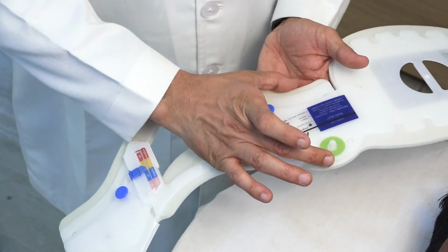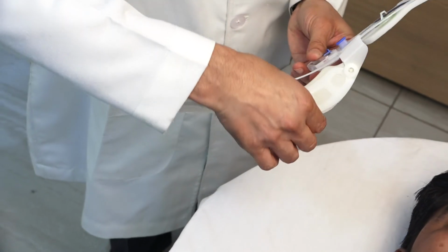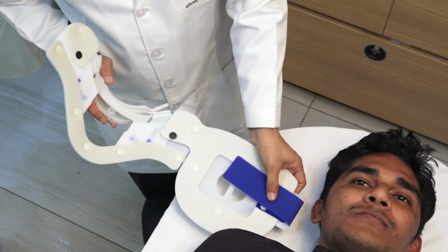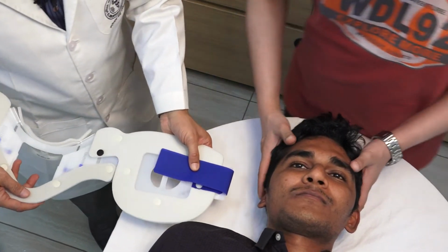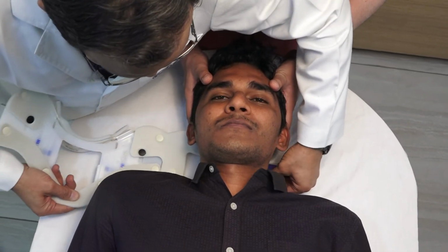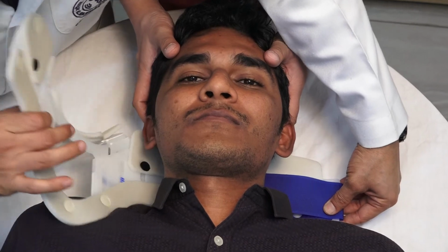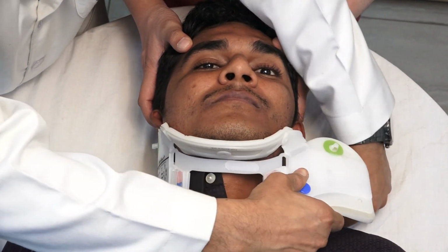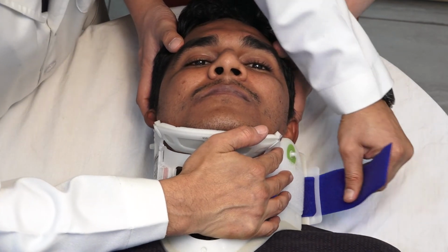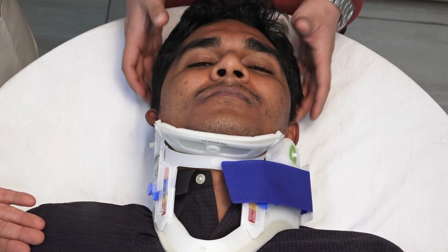So once we have adjusted the height of the cervical collar, this chin component of it needs to be flipped before use like this. Now this component goes in back. So just hold the spine, and then this part goes back. Once it goes back here, this part is rotated in front of the patient, so that the chin rests over this piece, and this Velcro tape comes in its place, and the spine is immobilized.